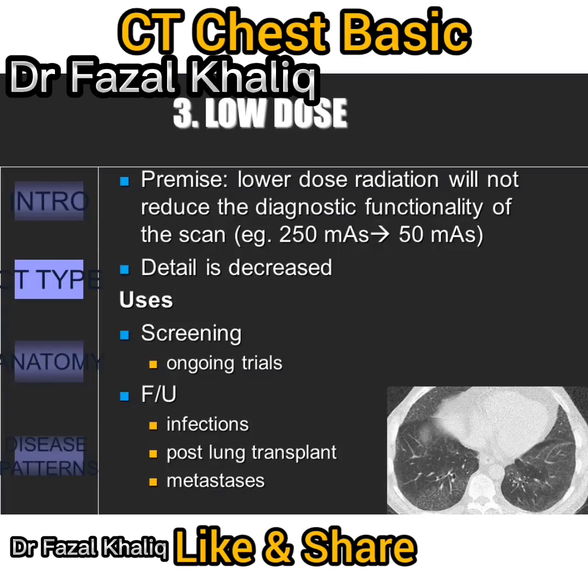Studies have shown that a substantial dose reduction is actually feasible for chest CT for 2 reasons. 1, contrast is already inherent in the chest, and 2, absorption of radiation is actually lower in the lungs. Low-dose chest CT can be performed without seriously jeopardizing the image quality.